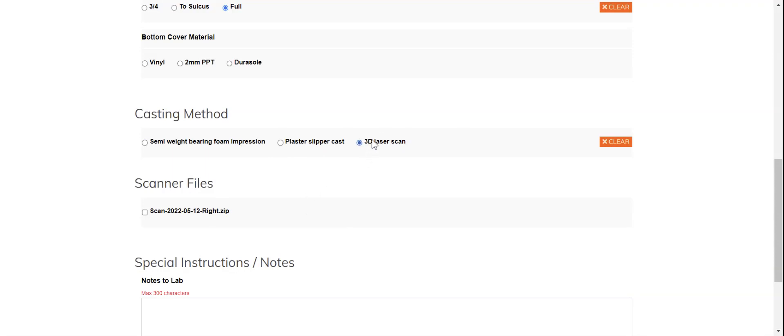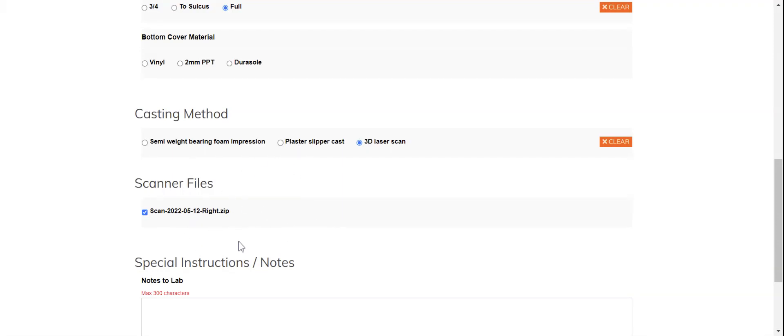If you are submitting a digital laser scan either of a physical cast or of the foot directly itself, hopefully by this point you've already uploaded the scan files and you'll need to attach those now. If you do not attach them, there's no other way for us to access these files and we'll be contacting you to organize a way to retrieve them.